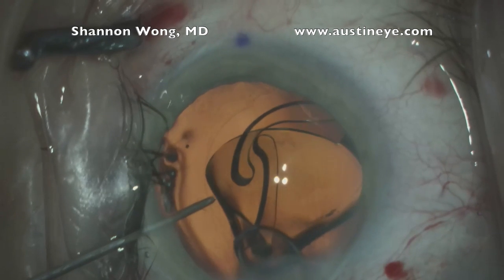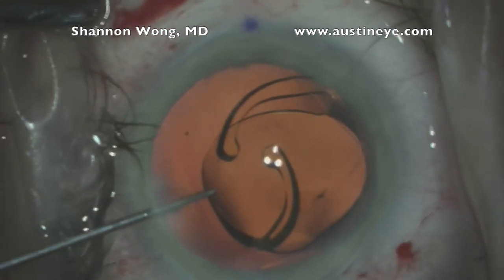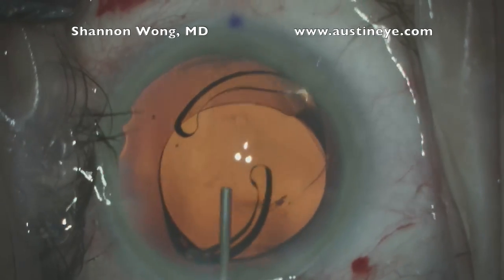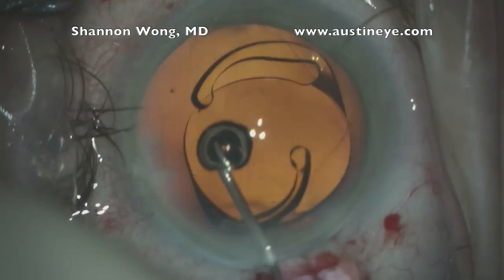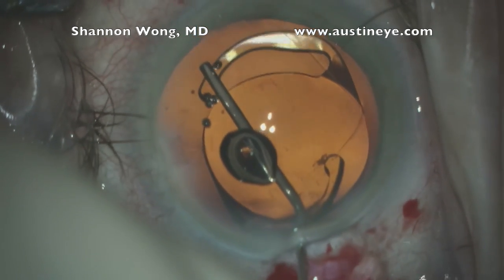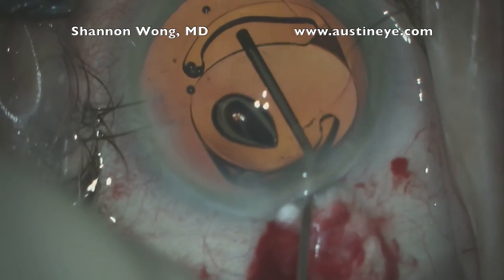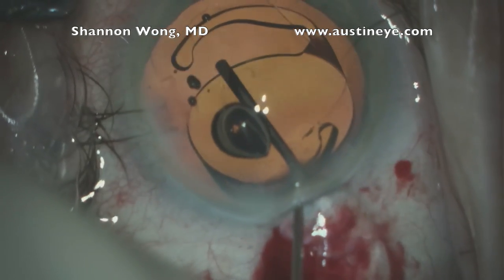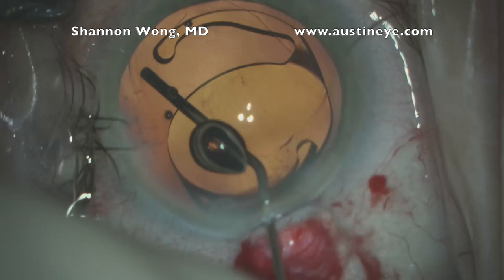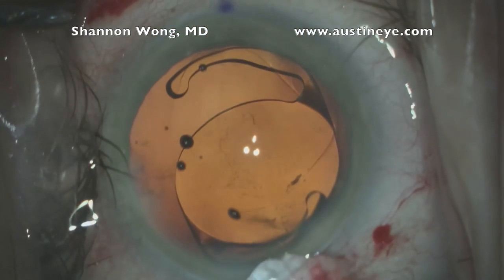We're inserting the ReSTOR implant. We use the cyclodialysis spatula to keep the optic inside the capsular bag as much as possible and not on top of the capsular bag. We want to make sure the leading haptic goes inside the bag. We use a generous amount of viscoelastic throughout this whole process to cushion the IOL and keep it floating within the capsular bag opening itself. The viscoelastic helps us to control exactly how fast and where we want to place this lens and its haptics.